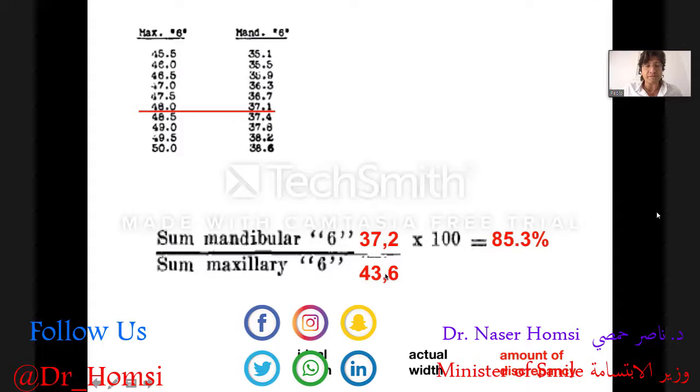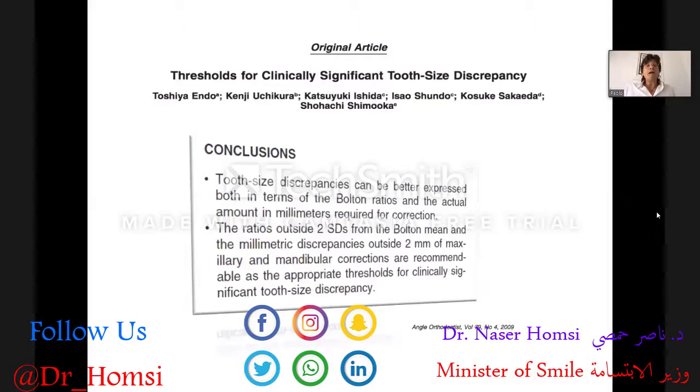43.6, it means ideal width is 48. Actual width is 43.6. And the amount of discrepancy is more than 4 millimeters. 4.4 millimeters is the amount of discrepancy between ideal arch and actual width of the teeth. So is it important to have this value?